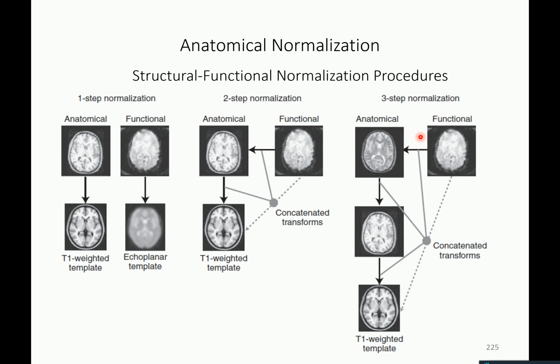So this normalization is never perfect in any sense, because in the end, and this is then where people start being interested in inter-individual differences, no 2 brains are alike. So you can force them to be alike, but then what you get is something that is interpolated and made up, or you cannot do it. The question is, do you want to make statements in your research about humans or about Aline?